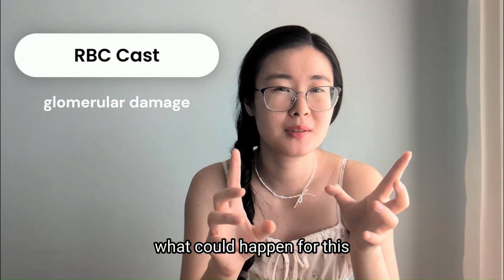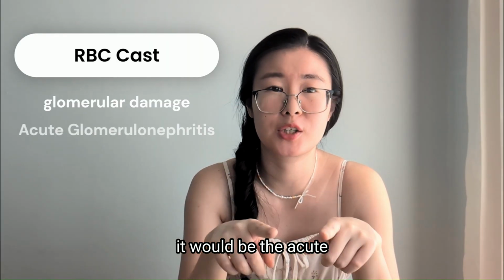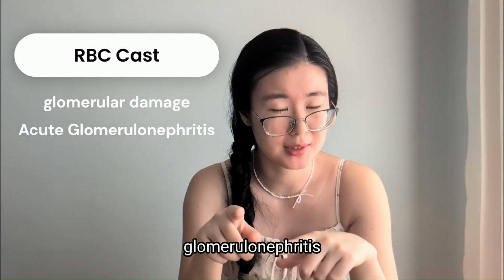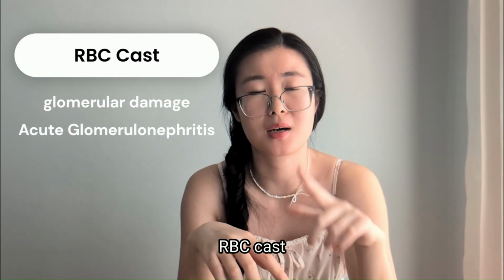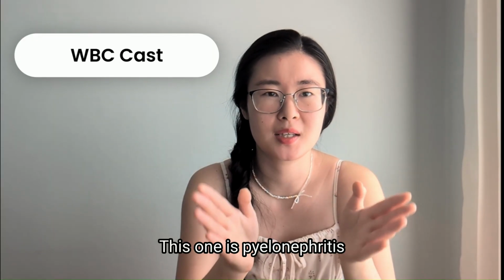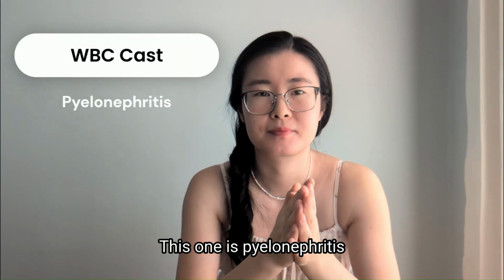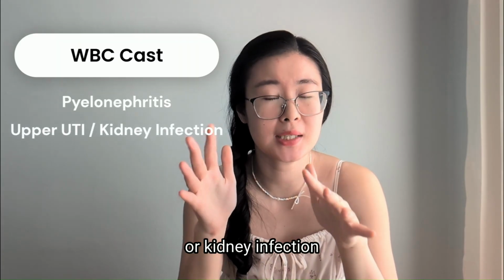What could happen for this? On your exam specifically, it will be the acute glomerulonephritis. So this is your answer in your exam for the RBC cast. Next one, WBC cast. This one is pyelonephritis. It is happening when you get the upper UTI or kidney infection.